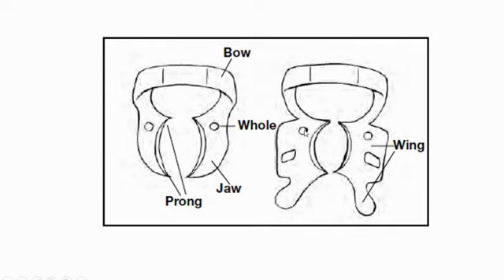तो आपकी किट में जो भी आप किट लोगे, चाहे जीडीसी की, चाहे कोल्टीन की, चाहे अदर कंपनीज विच आर अवेलेबल, तो मोस्ट ऑफ द किट्स में यू विल हैव दिस विंग्ड वाला क्लैम्प्स. ओके, तो उसके कंपोनेंट्स क्या हैं, ये बो है. बो को क्या याद रखना है आपको, बो डिस्टल पार्ट में होगा. जब आप इस क्लैम्प को लगाओगे, दिस बो शुड लाई ऑन द डिस्टल पार्ट. फॉर एग्जांपल यू आर अप्लाइंग इन द मैंडिबुलर मोलर, तो यू विल जस्ट अप्लाई सिमिलर वे. जब ये मैंडिबल में करोगे तो मैक्सिला में उल्टा कर दोगे, और ये डिस्टल ही आना चाहिए, बस ये याद रखना है आपको. तो इन रूटीन केसेस यू पुट इट डिस्टली, बट इन फ्यू केसेस यू कैन पुट मीजली. आई विल टेल यू. एंड दिस इज द विंग्ड एंड विंगलेस.